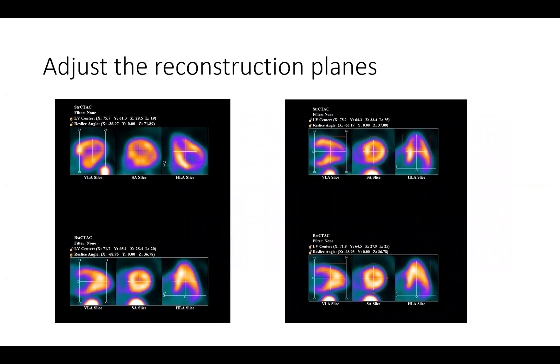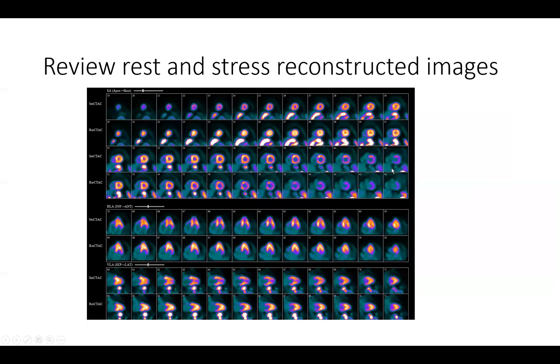The next stop is to do the reconstruction images. Immediately here on the left hand side you can see in the stress images on top there are issues with the reconstruction where the axis of the heart is tilted. With a very simple rotation you can end up with the corrected images on the right — you click the processing button and then you will get these images.